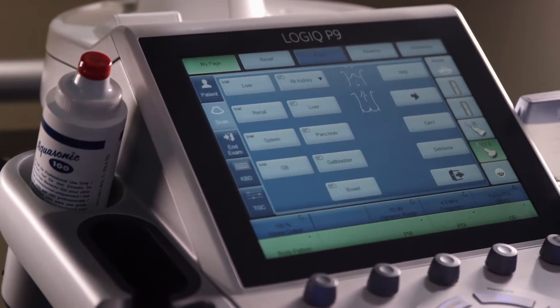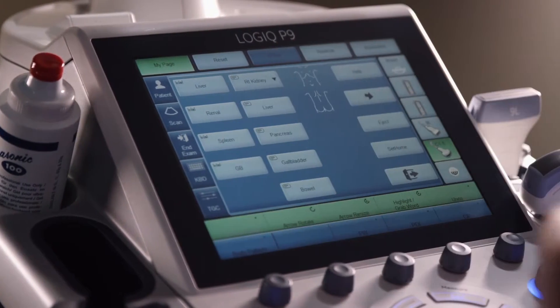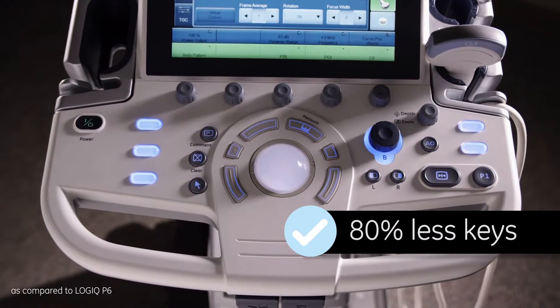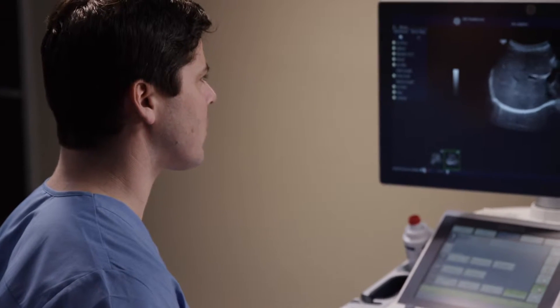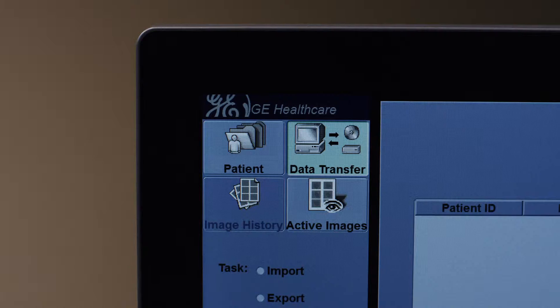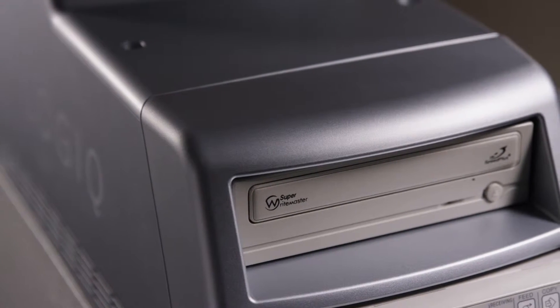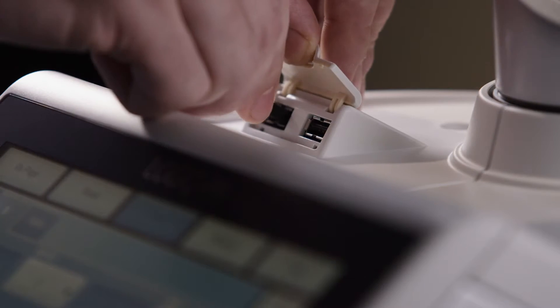The large touch panel provides easy access and visibility to functions and features, and the streamlined keyboard has 80% less keys. Send, manage, and store your image data with a 500GB hard drive, and export or transfer to a CD, DVD, or USB memory stick.